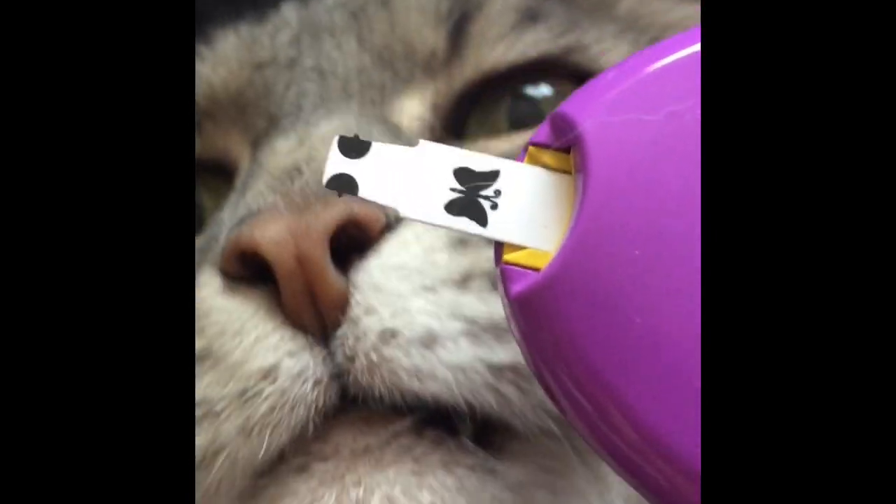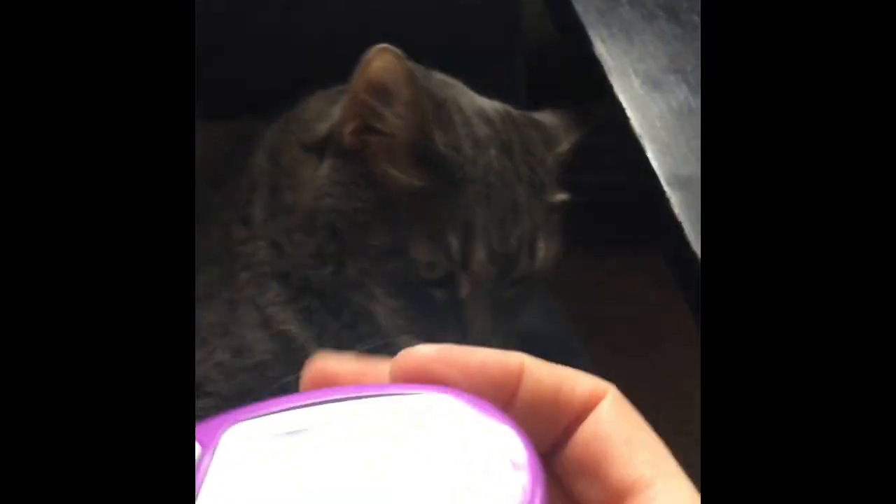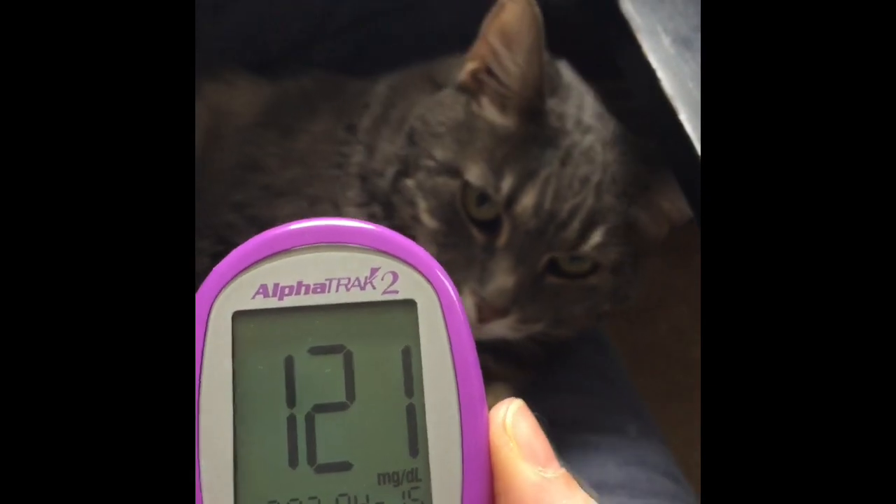There's a little black spot on the edge of those test strips — just hold that up to the dot. And that's it — I just touched it to the blood drop. Now it's going to go through. 121, she's fine. Then I take the cotton pad and give it a little squeeze.